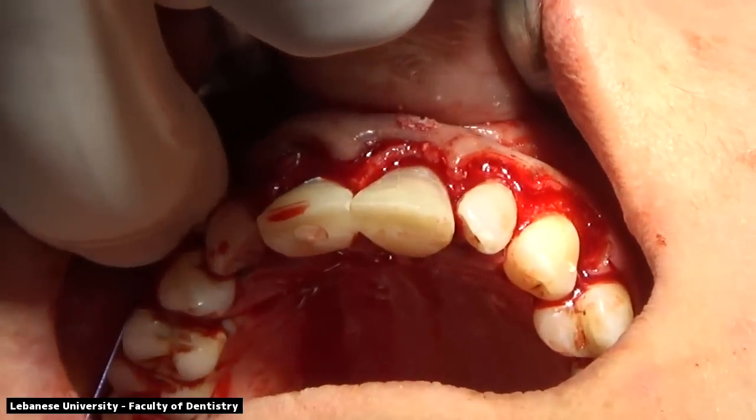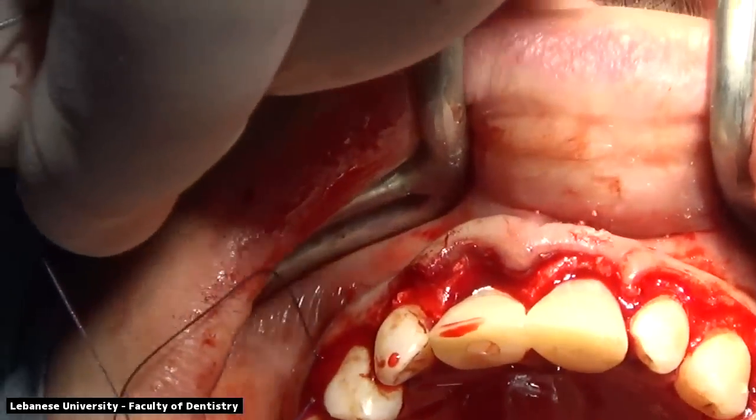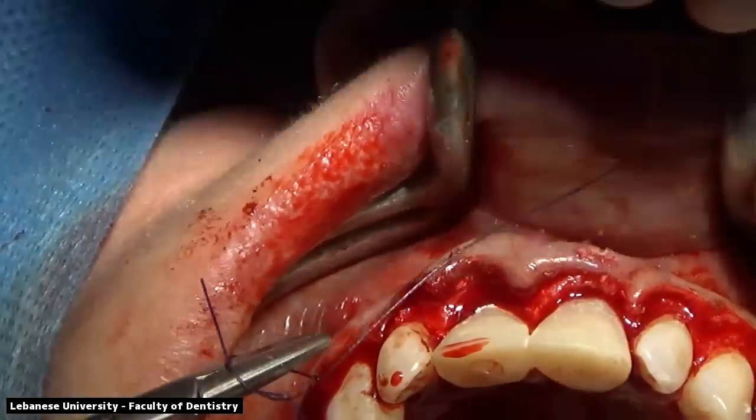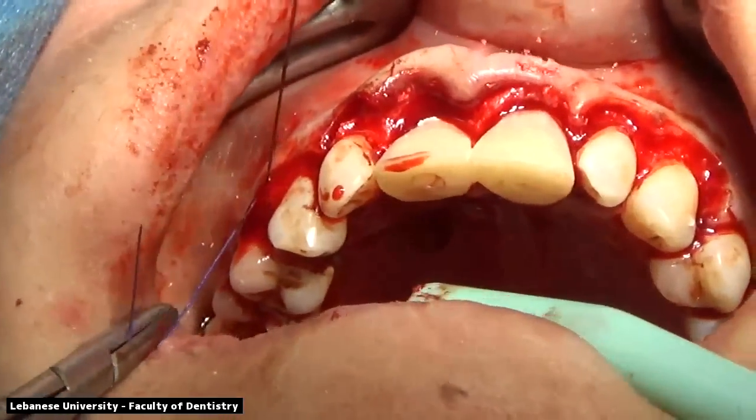Going under the embrasure area and back to the buccal aspect. And making sure that the knot is on the buccal area, not on the tip of the papilla, but in the middle of the papilla without any tension. A simple interrupted suture is being used in this case.